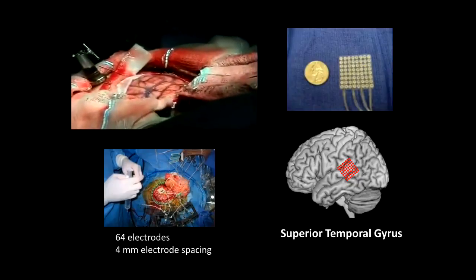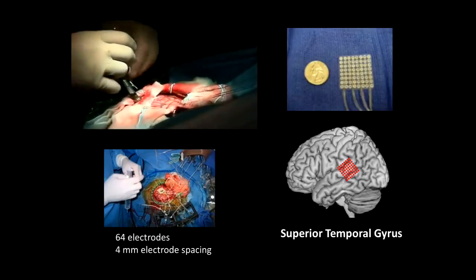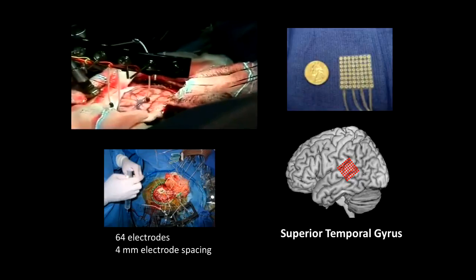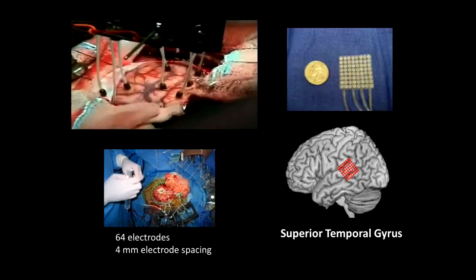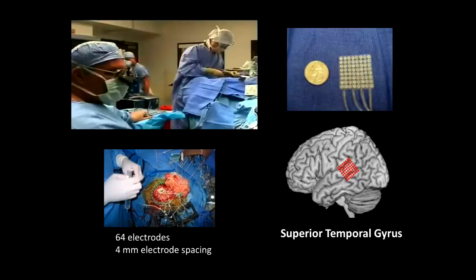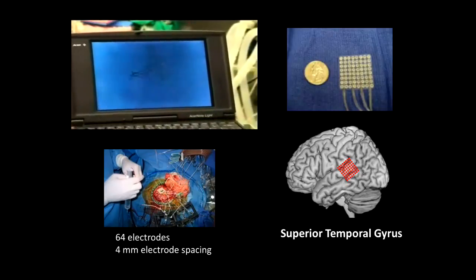You feel some vibration, Susan. That's normal. We're going to get ready to do the mapping. That's Mitch. Now they're going to do electrical mapping.